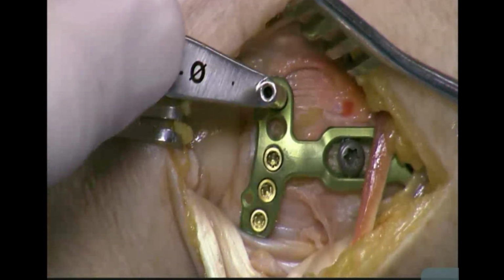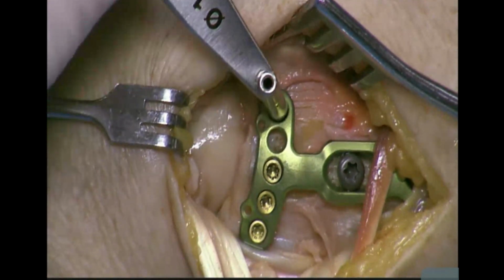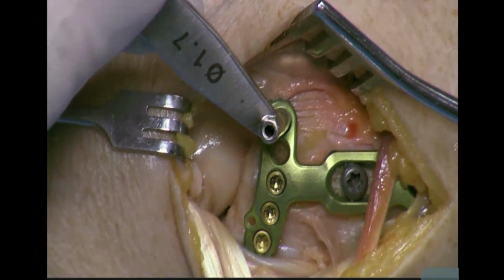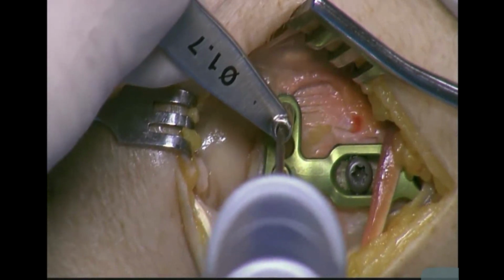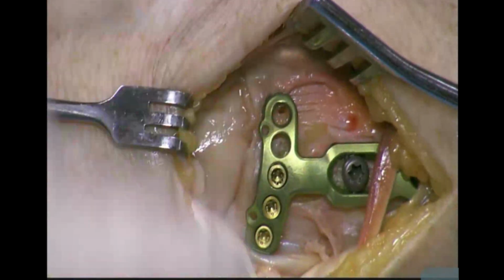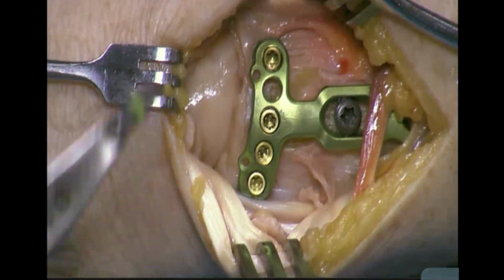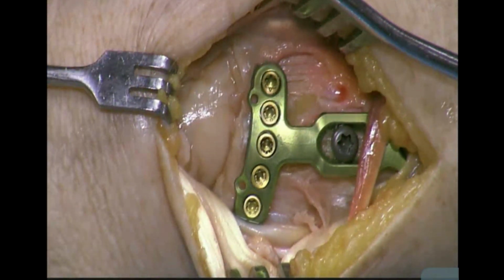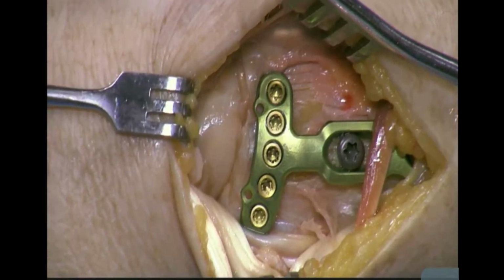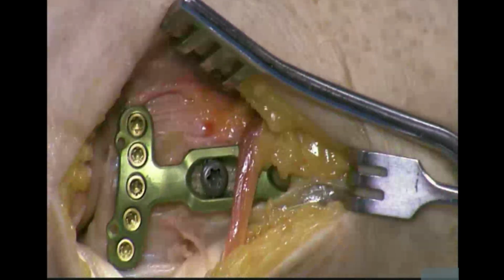And this drill guide is designed to seat within the plate. And inspecting that, I can look at the joint surface, know where I want to go, and aim this plate accordingly. So this one we're going to go just a little bit ulnar even. The screw is not in the joint. I will fill one last articular screw hole. This is cinched up and locked, and now remaining, we're just going to switch around and secure the rest of the plate on the shaft here.